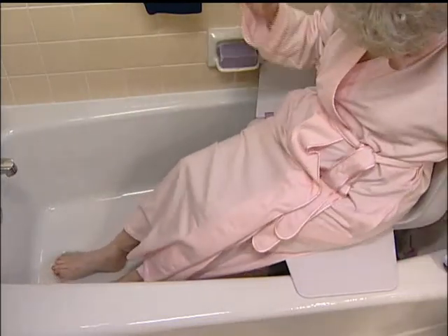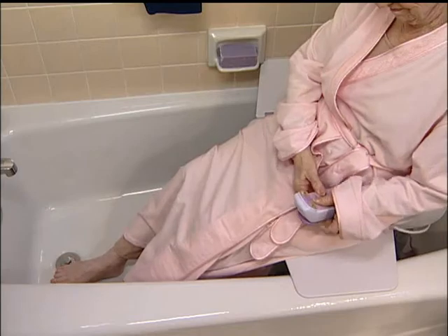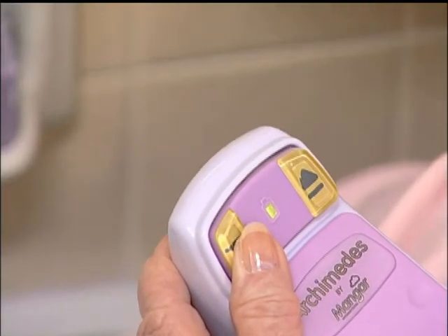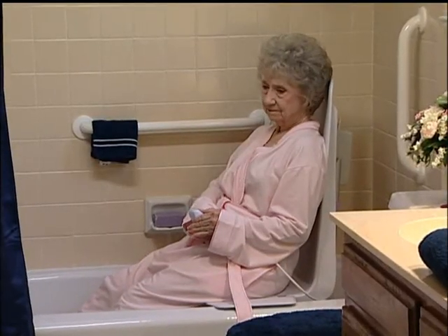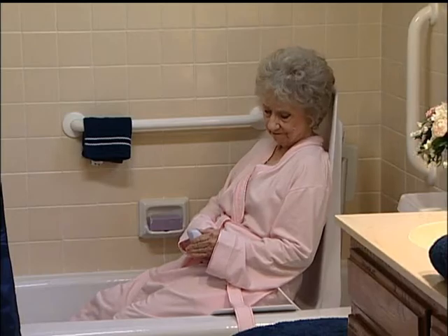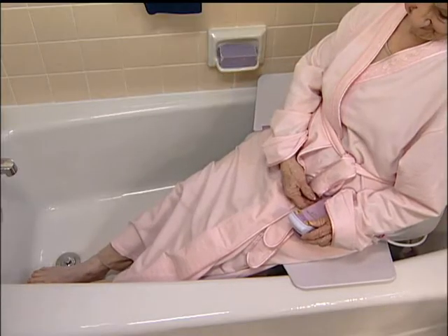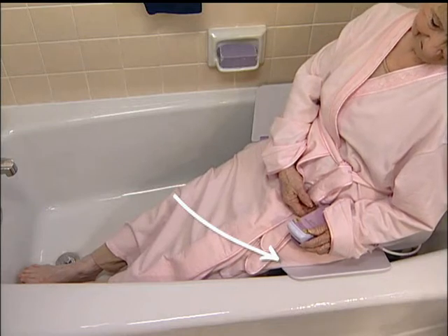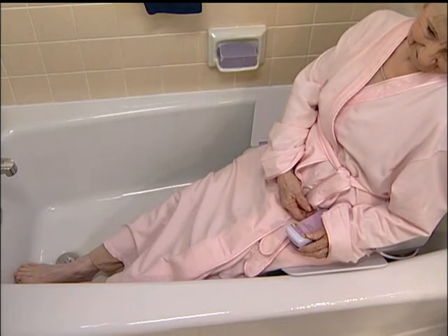Make sure you're centered on the seat and your feet are at a comfortable angle. After you're comfortably seated on the Archimedes, simply press and hold the down button to descend into the tub. You may stop the Archimedes at any point by releasing the button. If you continue to hold the down button, the Archimedes will stop automatically at the lowest point. Please note that the side transfer flaps automatically fold up as the bath lift descends.